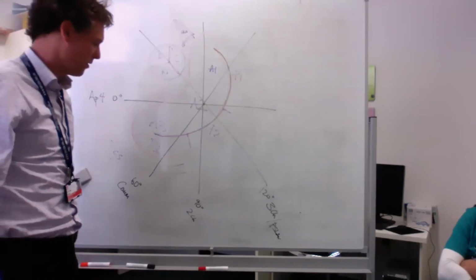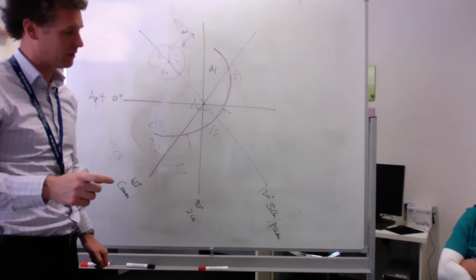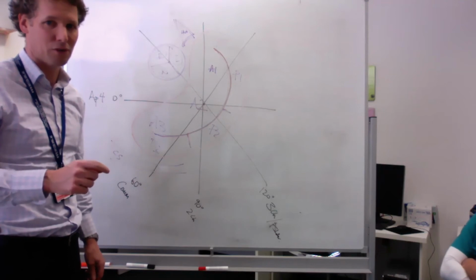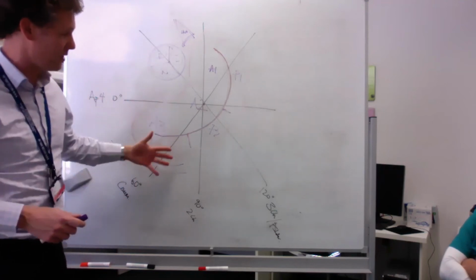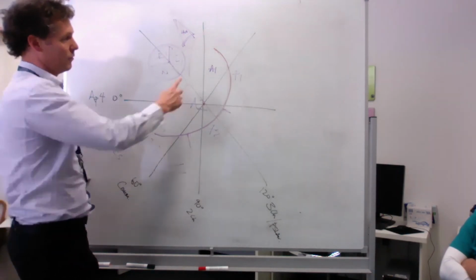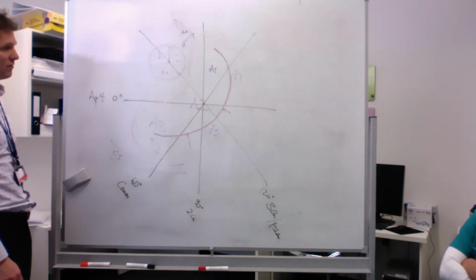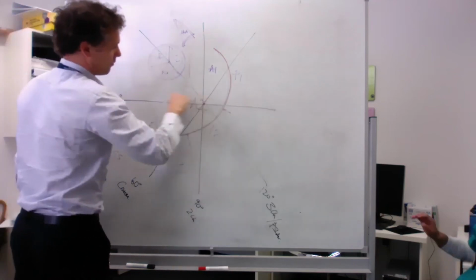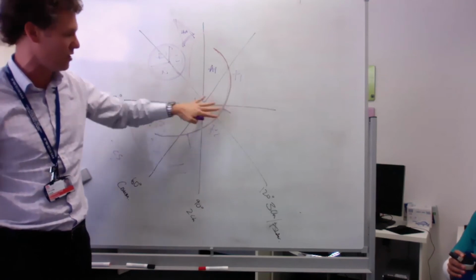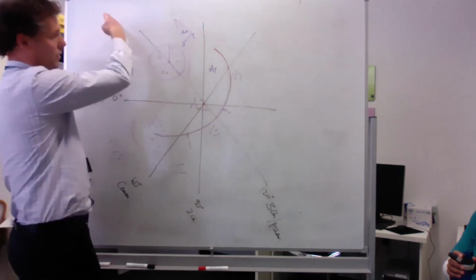I don't think it's pass or fail to get the cusps in the exam, to be honest. What is pass or fail is that you've got to be able to assess the severity of the mitral regurg. I think it'd be fair to give you something in the exam like the diagram that I showed you, and you'd be expected to realize that the apical 4 goes through anterior and posterior, and you should be able to figure out that the 3-chamber goes through the aortic valve.